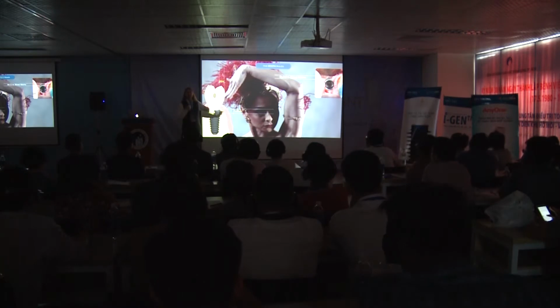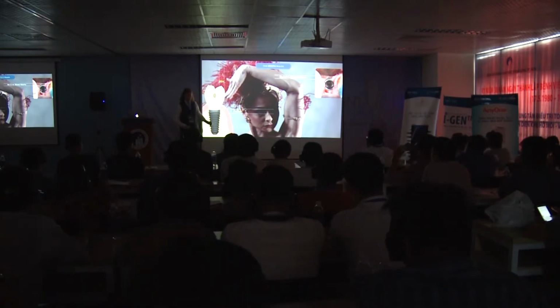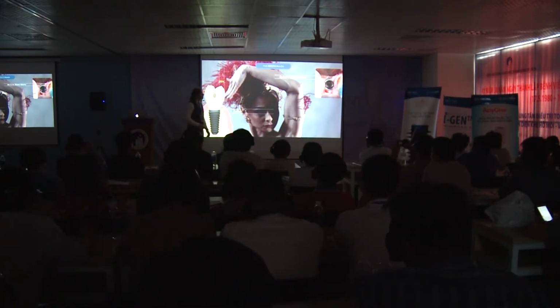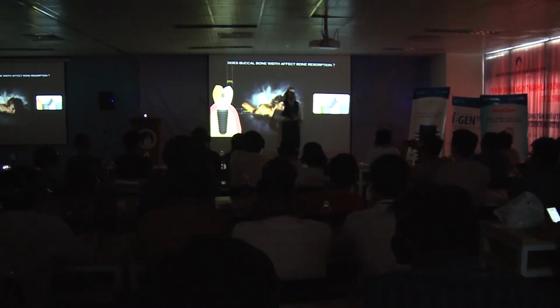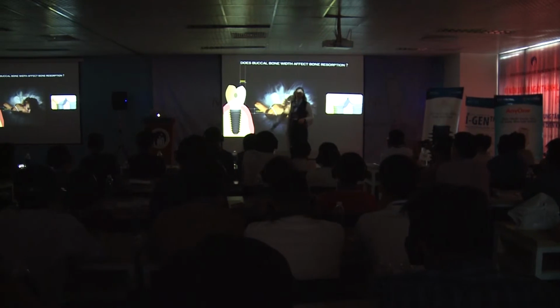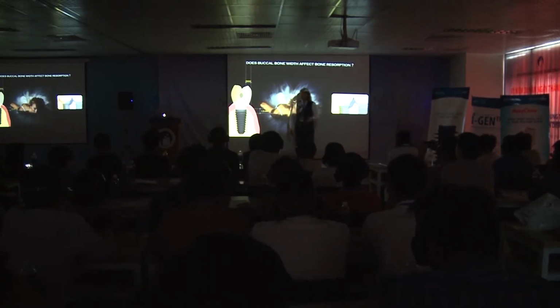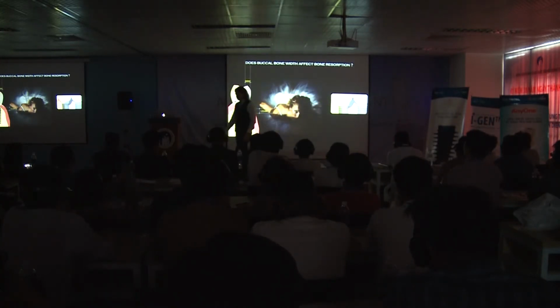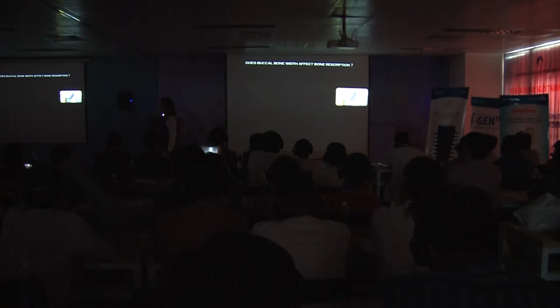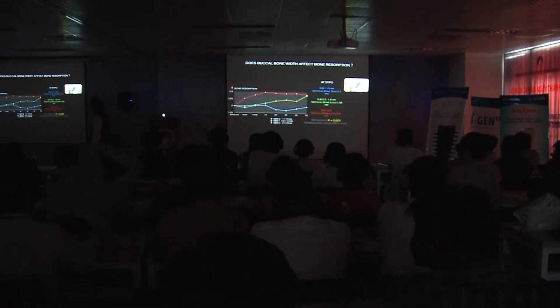We measured the thickness of the bone on the buccal side. And we compared whether the buccal bone measured after implant positioning was affecting the bone resorption. Yes, it was.